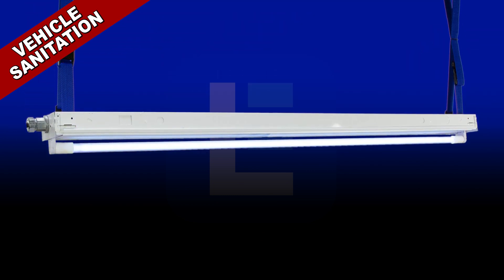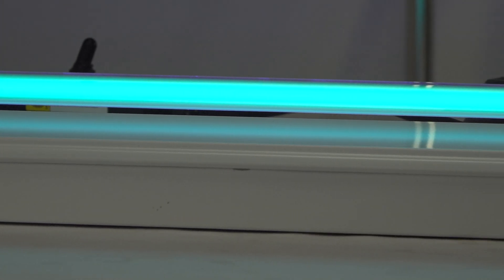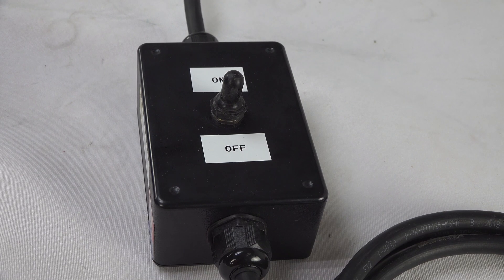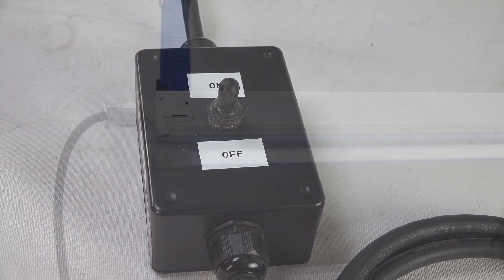Vehicle sanitation lights. This slim profile lamp measures 50 inches wide and offers a 5 to 10 minute exposure time. It includes adjustable nylon straps for mounting inside vehicles. An inline switch along the cord allows operators to activate and deactivate the unit outside of the vehicle after temporary installation.